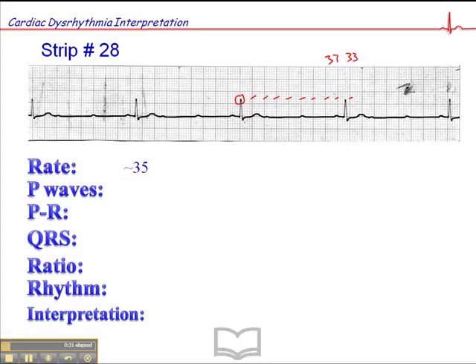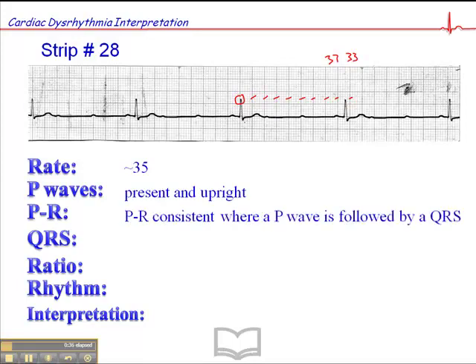The P waves are definitely present, upright, and consistent in morphology. The PR interval is consistent where P waves are followed by QRSs — the PR interval here is identical to the PR interval here, and here, and here. Keep in mind, we don't see that with a third-degree AV block or a second-degree AV block type 1, also known as a Wenckebach block. So we can eliminate both of those right off the bat.